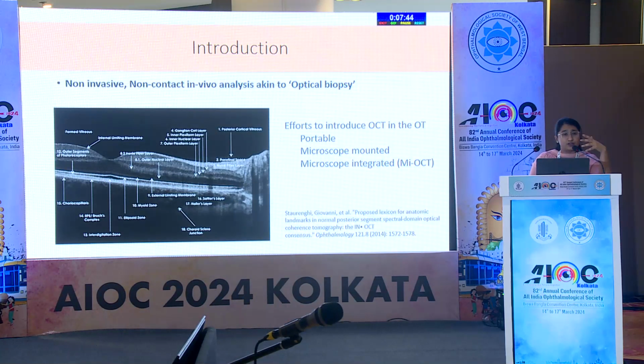The advantage of this would be that the alignment of the axis was such that you could operate while you were seeing the OCT. The surgeon could see it, or it could be displayed on the heads-up display using the 3D system. However, the assistant could not see this OCT.